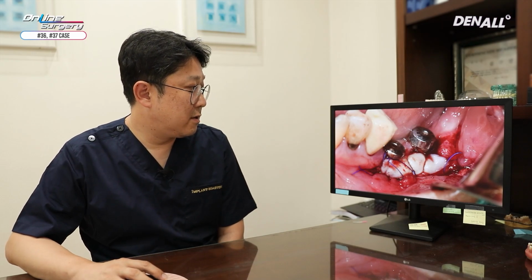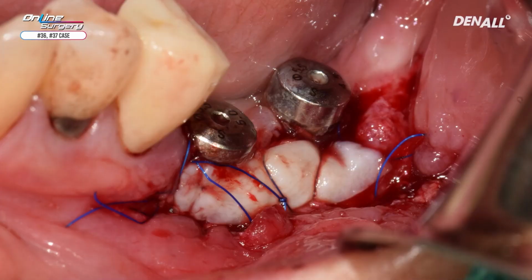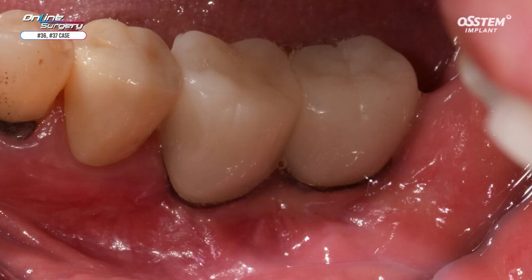About 2 months after implant placement, FGG was performed to secure keratinized tissue on the buccal side. As the bite was low, final prostheses were not delivered. Now, temporary teeth are used. On the buccal side, some keratinized tissues were made, not much, and the patient can eat without discomfort.